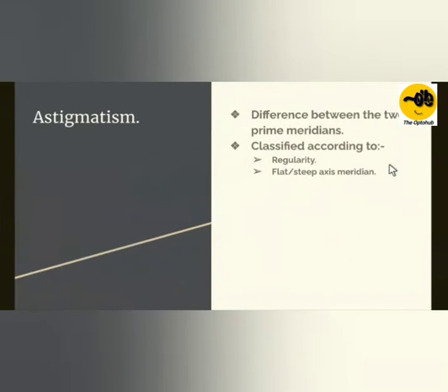Right. So now, what do we do on the topographer? First things first, we'll understand astigmatism. Again, we all are smart enough to understand what astigmatism is. It is nothing but the difference in the radius of curvature or in the dioptric values in two semi-meridians or in two principal meridians. And the astigmatism can be further divided into regular, irregular, with the rule, against the rule, oblique astigmatism, and there are a few more types. But we'll stick to a few of these for this session.